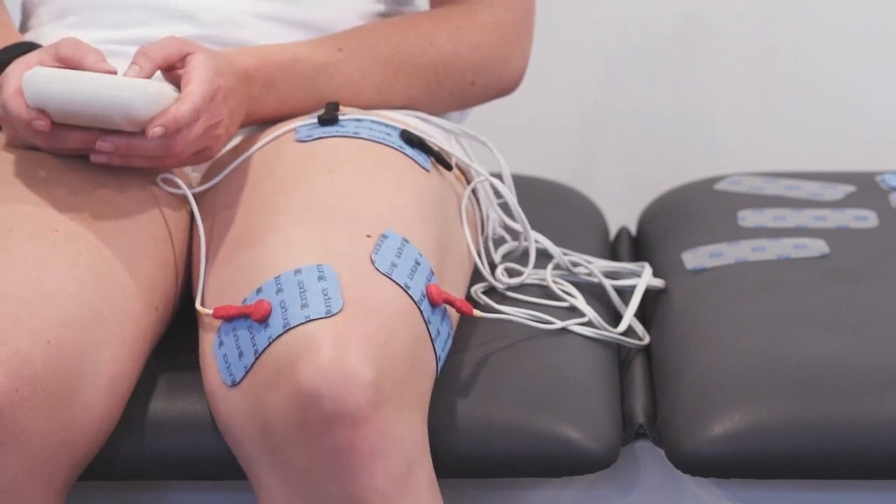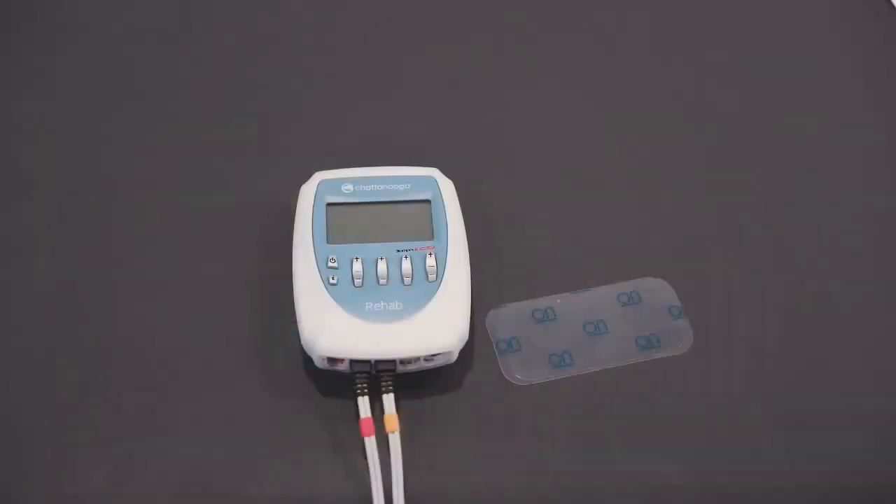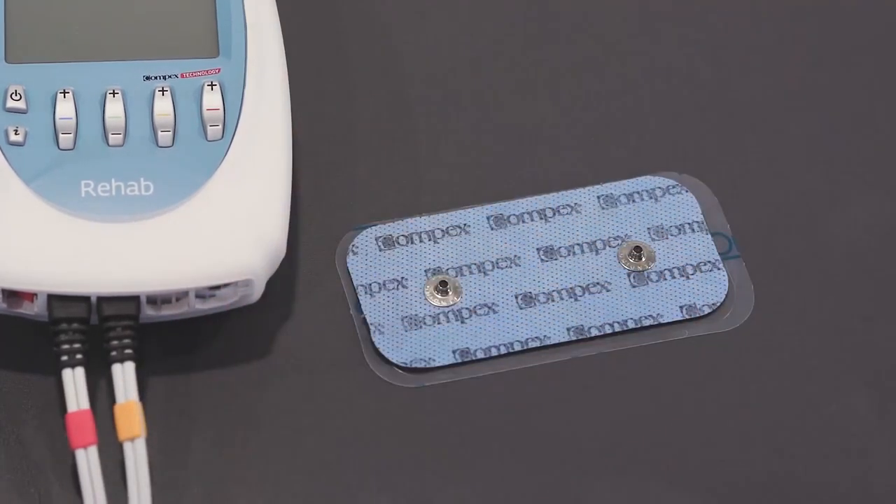At the end of your treatment, turn off the machine with the power button and disconnect your electrodes. Make sure that you place your electrode pads on the side marked "on" as opposed to "off", due to the protective film that it has. This will maintain the longevity of your electrode pads for up to six weeks.